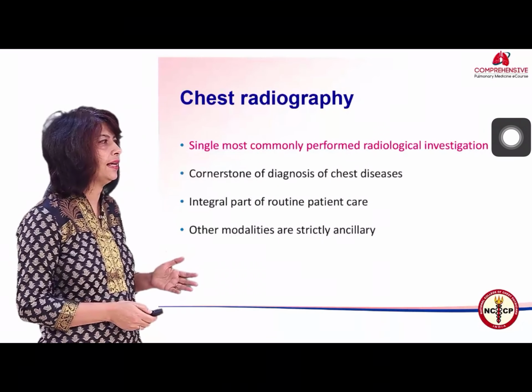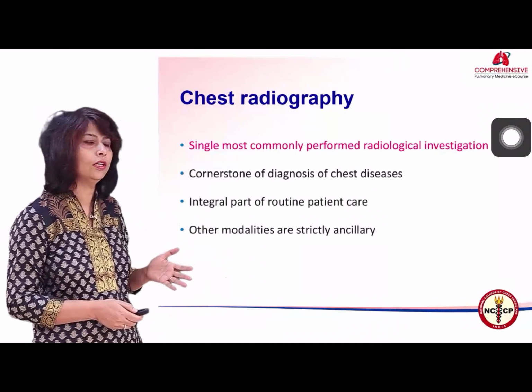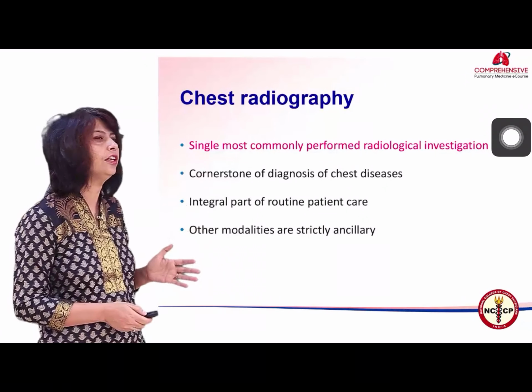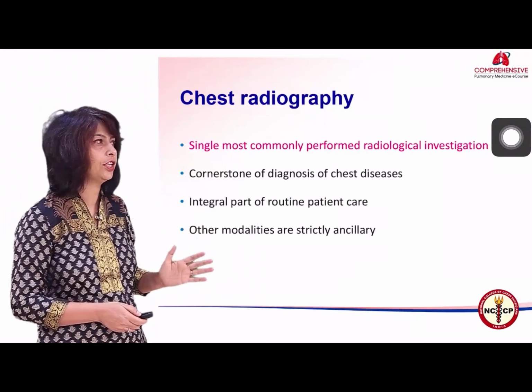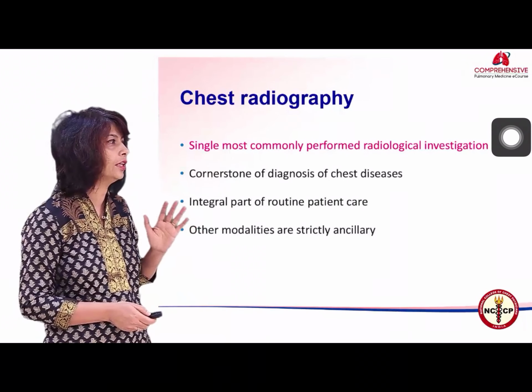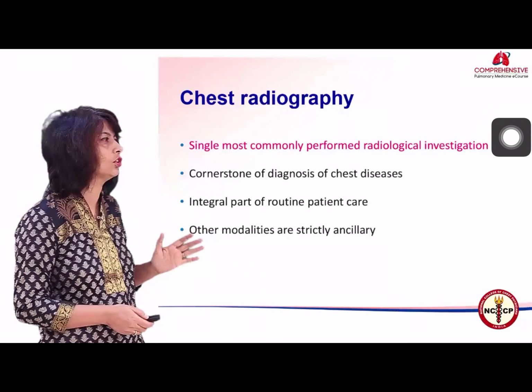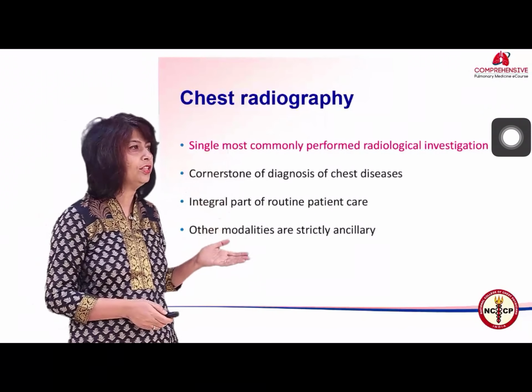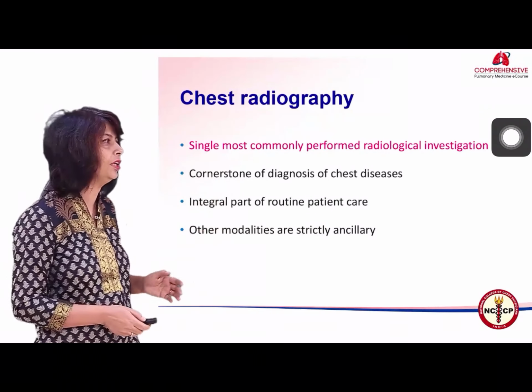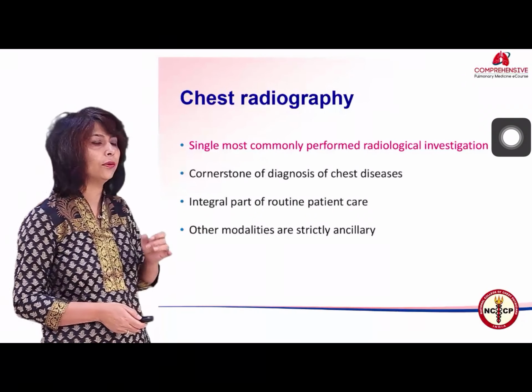As I already said, if you see any busy radiology department the world over, a chest X-ray will definitely be the most commonly performed radiological investigation across all modalities, including ultrasound. A chest radiograph is most certainly the most commonly performed radiology investigation, whether it is the emergency, the wards or the OPD. Everyone needs to interpret a chest radiograph.